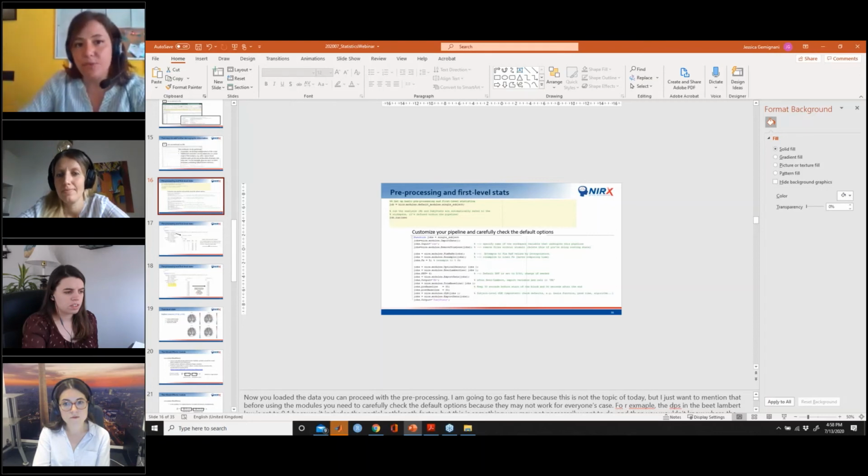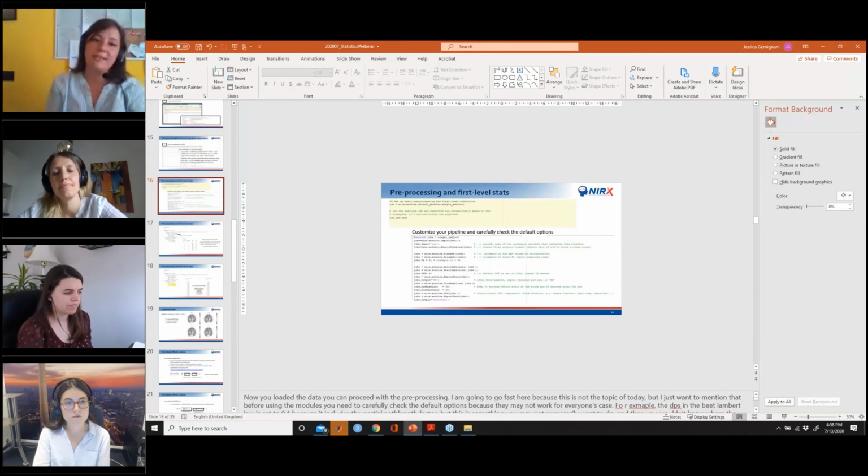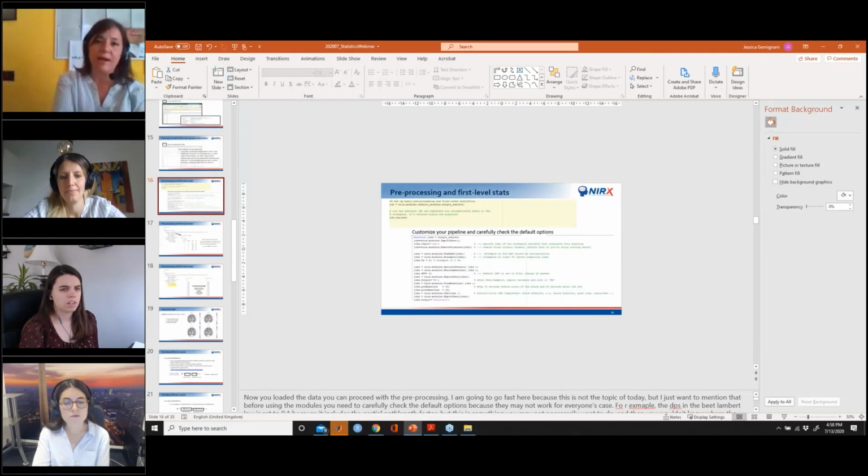that the models are solved at channel level and component level. So yes, the components should also undergo multiple comparisons if you take them all together. If you want to look at everything, oxy and deoxy, they should also undergo the same multiple comparison, because you are actually performing several tests in parallel, but they're actually independent. So you are considering a different time series all the time.